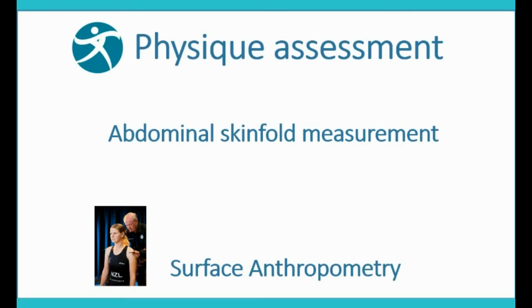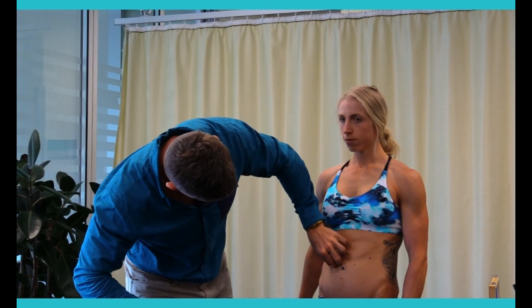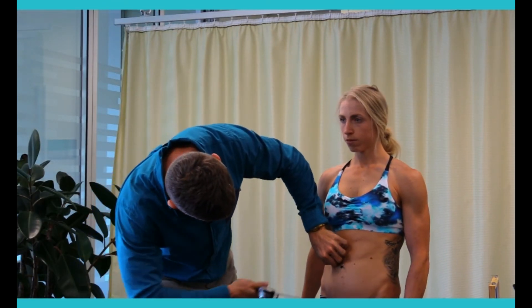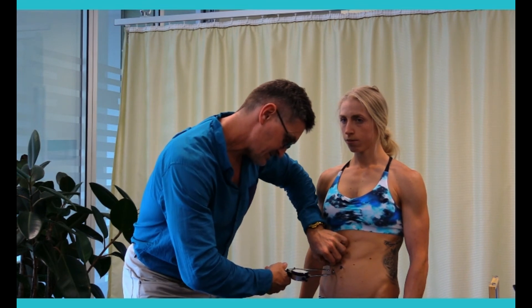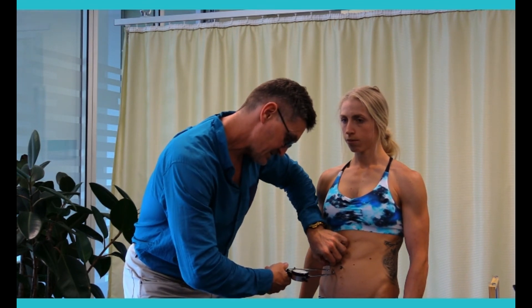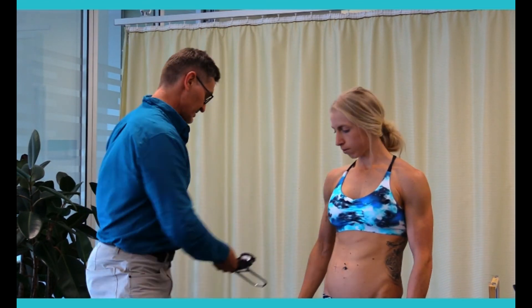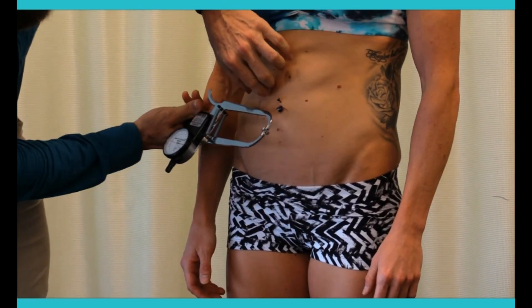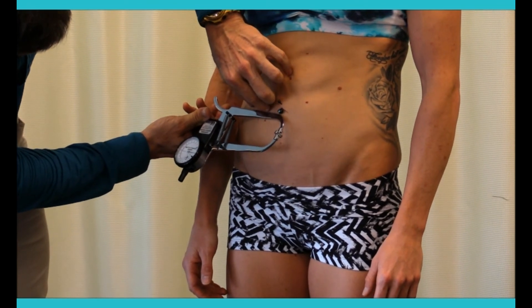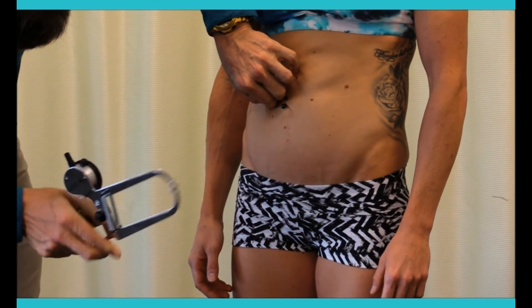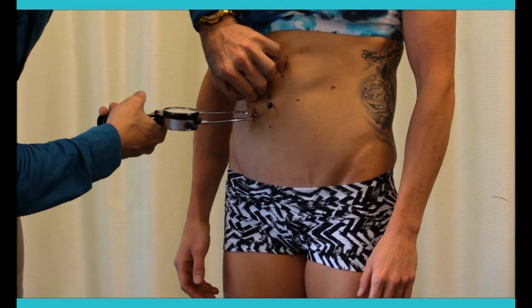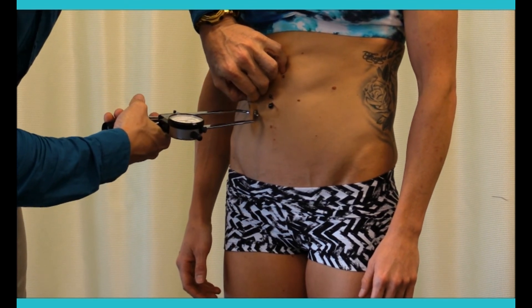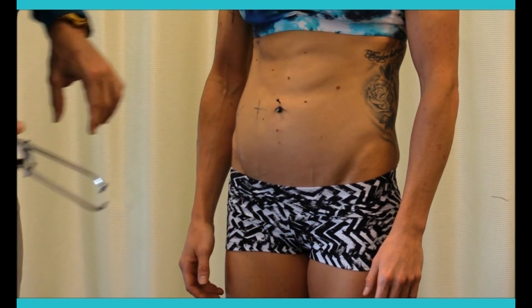Abdominal skin fold measurement. The reading is 3.1.